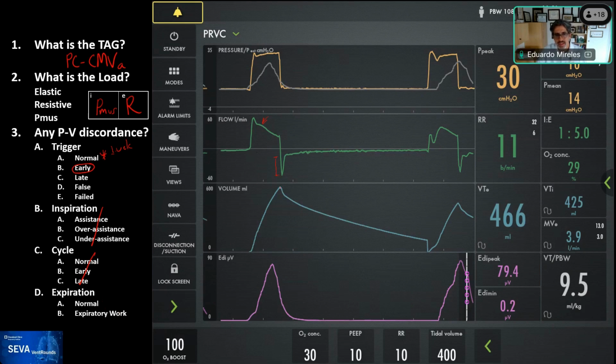You can see there's a rapid component, a rapid time constant, and a slow component. The amount of air exhaled here is around 100, because we measured it on this patient. Because this patient was requiring higher pressures, we believe this is likely all airway and circuit.